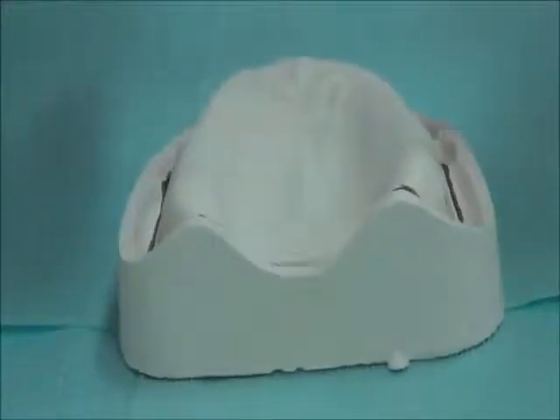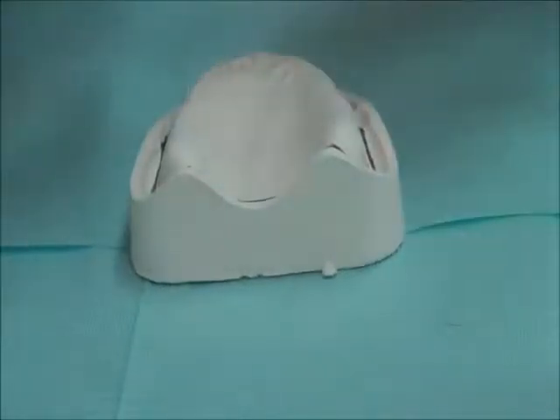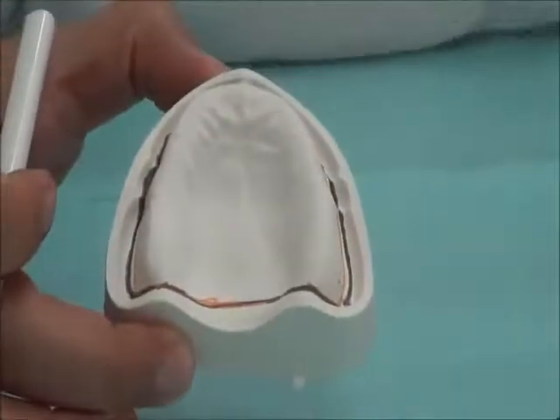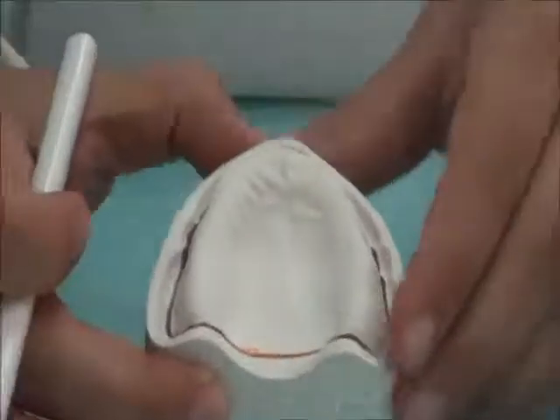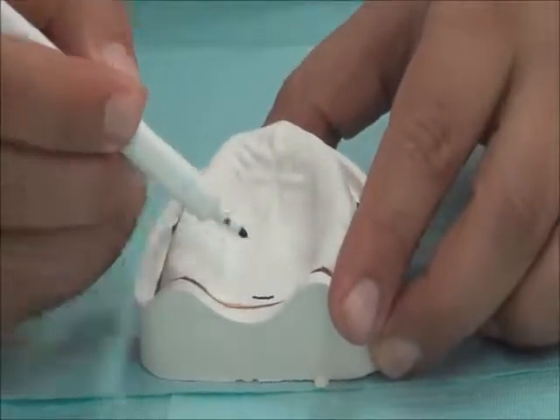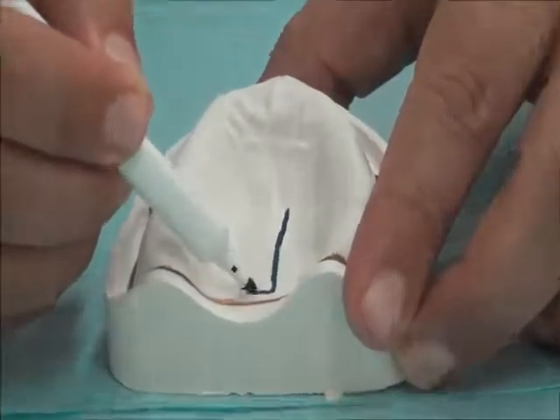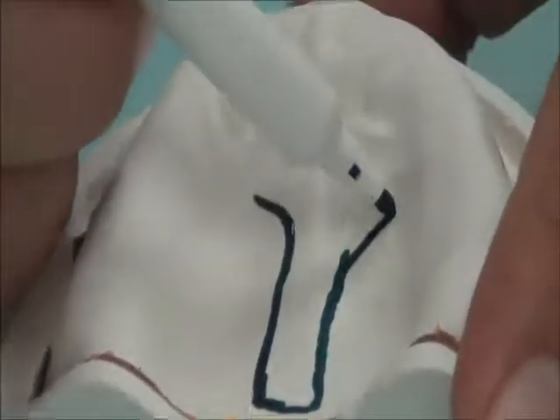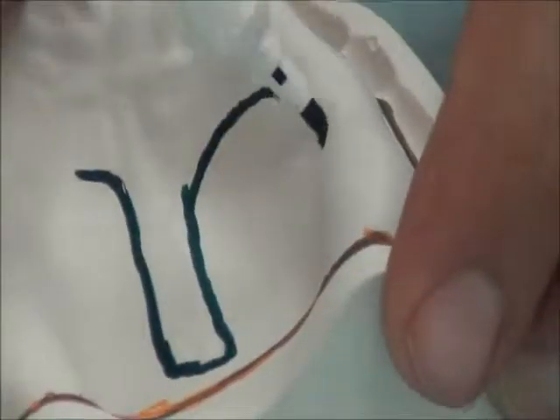The third step is we draw the outline of the spacer. And here we're following the partial spacer shape. So we're going to draw the line over. We're going to add the lines over the areas that we should be relieving. So mid-palatine suture, just revising them, the rugae area, the crest of the ridge, up to the tuberosity. We exclude the tuberosity.